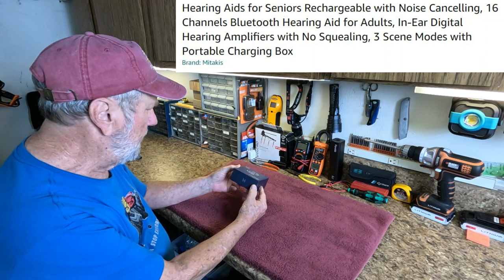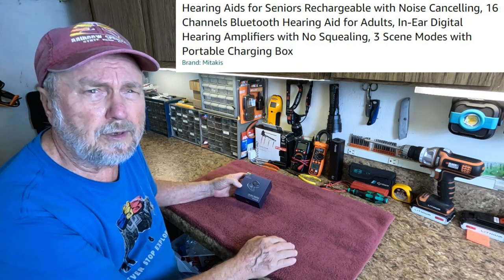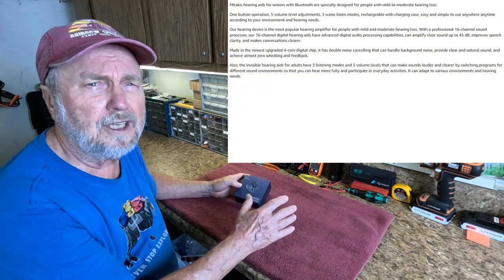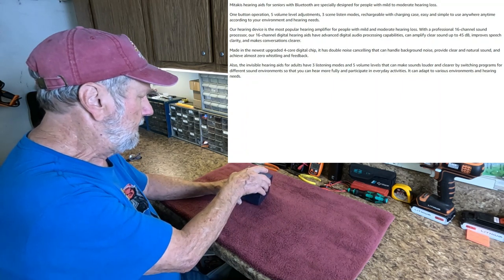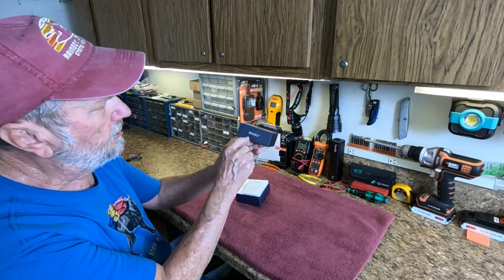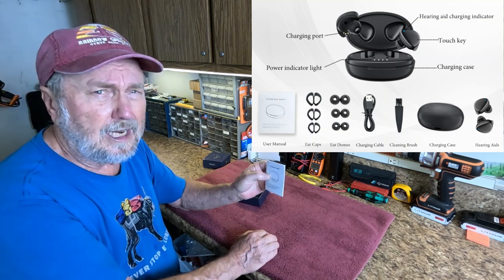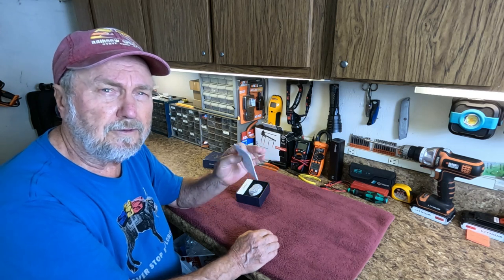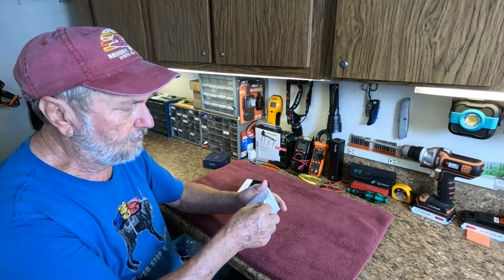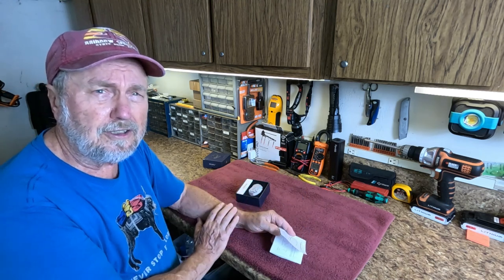I'm going to show information in the upper right hand corner that is going to help you see some details about the product that I don't have enough time to cover in the video, so keep a look at that. Take the lid off and this is the company right here. I like to always review the product before I create the video so I know what I'm talking about.